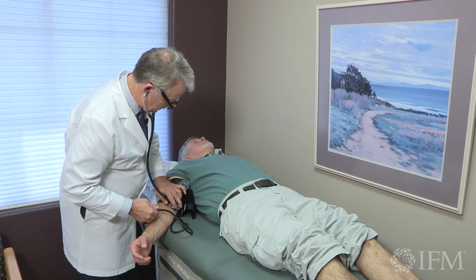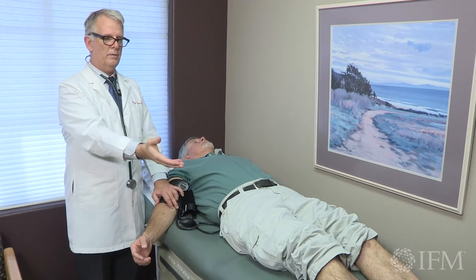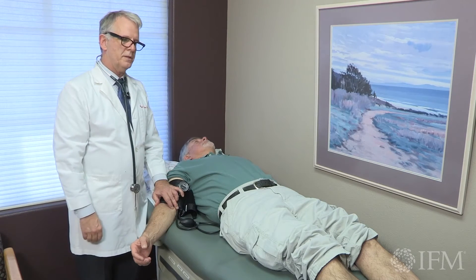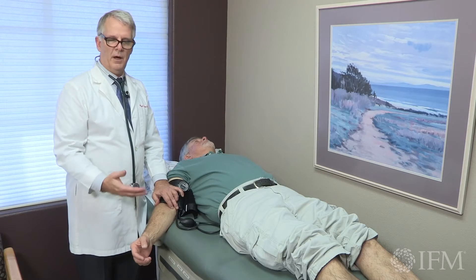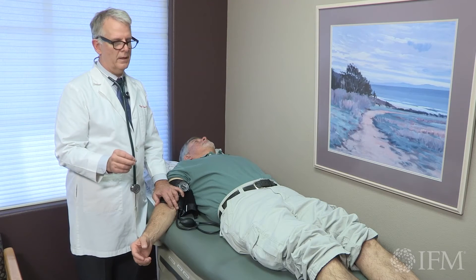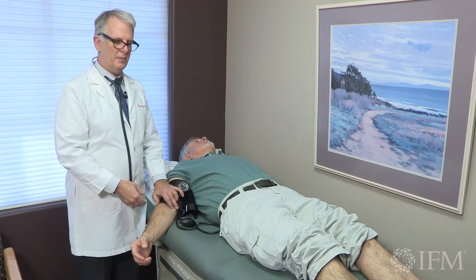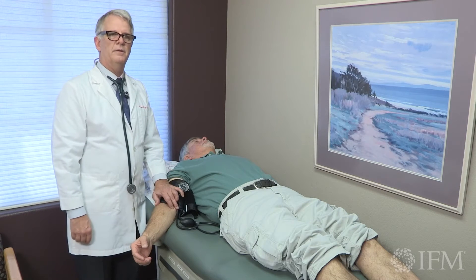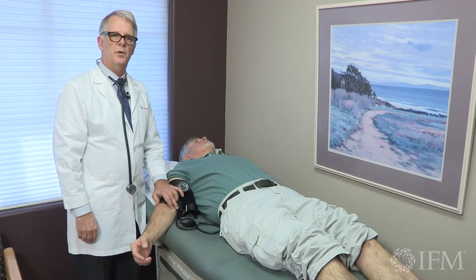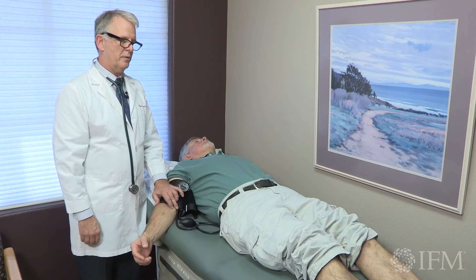142 over 78. So we know from his ankle Doppler that we started picking up a Doppler pulse at around 140, and we also note that it was loudest at around 110 to 116. With his stethoscope, which is less sensitive than the Doppler, we picked up his systolic at 142. So we know his ankle arm index is greater than 0.9.